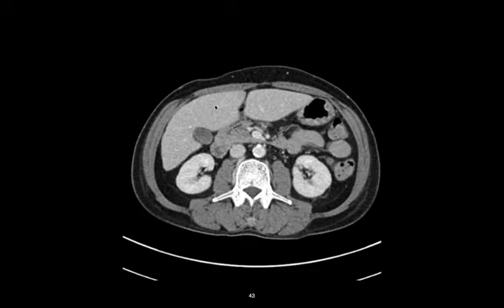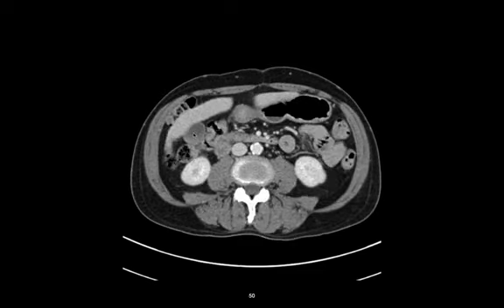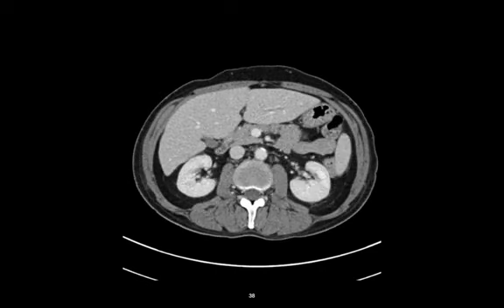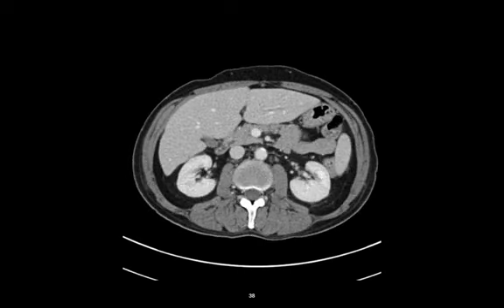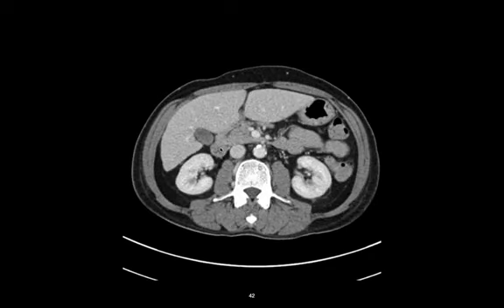I'm going to show you, and this one I found a little bit harder, because here's the right lobe of the liver and the left lobe, and there's our gallbladder. The gallbladder makes bile, and I just watch, it's going to dump into the duodenum. So there's our duodenum right there. That's our second part of the duodenum. And how do I know it? Because you can see where the bile duct is going to dump into it. So this is the second part of the duodenum.